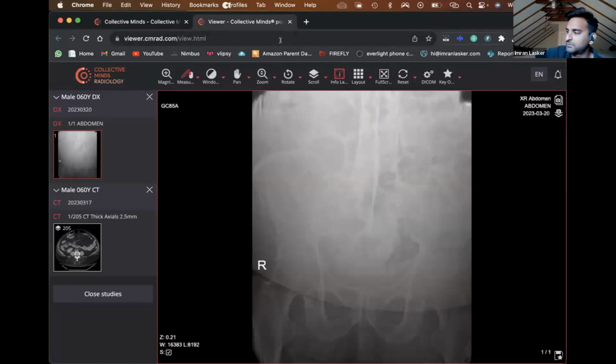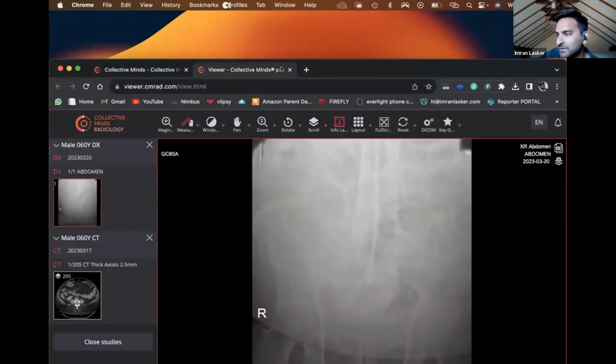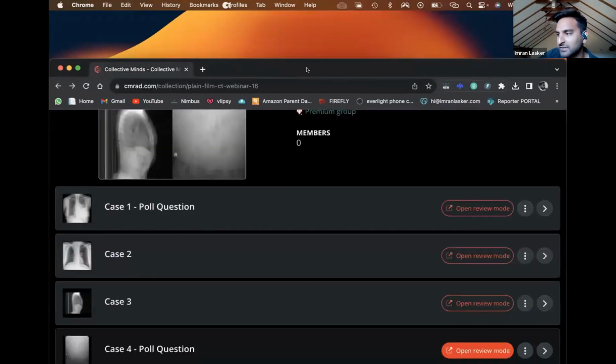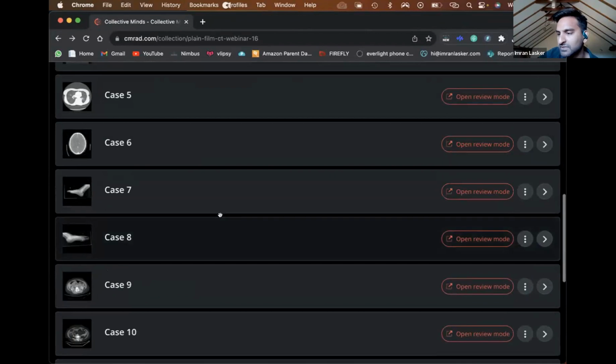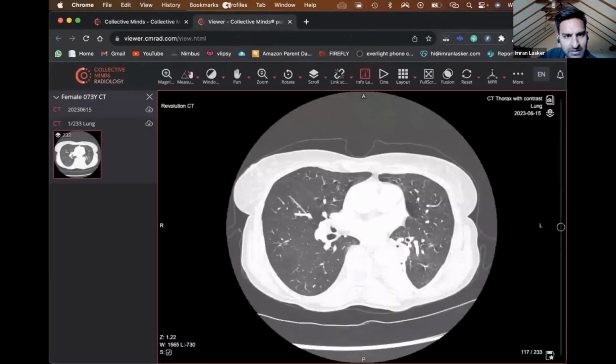Lymph nodes, generally speaking, would be because of some sort of underlying infection and that kind of thing. But feel free to correct me. I thought this would be an interesting case because sometimes a second finding, I've said this before on a few different talks, the most commonly missed finding is a second finding. And in this particular case, although it's not entirely clinically relevant, the second finding was that the patient has underlying ankylosing spondylitis. So I think that brought in a fair bit of discussion from what I can see.